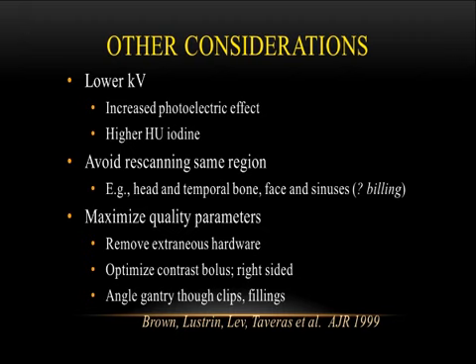Okay, avoid scanning the same region. So if you're interested in temporal bones, you can do a head CT, and you can extract the temporal bone out of that head CT, especially if you're doing a helical scan. Similarly, same thing for the sinuses, same thing for the facial CT. There's no point in repeating the scan. By the way, when you do that, you cannot bill for 2 exams, and that's billing fraud. So that should be kept in mind.